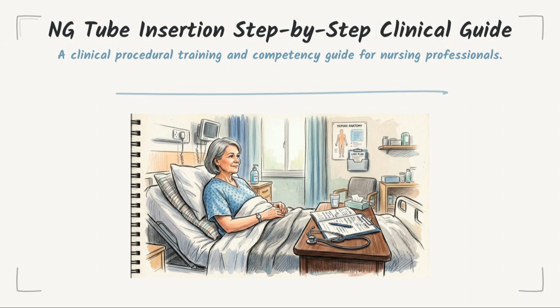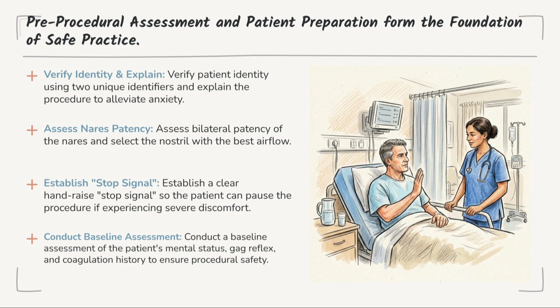Welcome to this clinical training video on NG tube insertion. This guide is designed to provide nursing professionals with a clear, step-by-step approach to ensure procedural competency and patient safety throughout the process. Safe practice begins with thorough preparation.